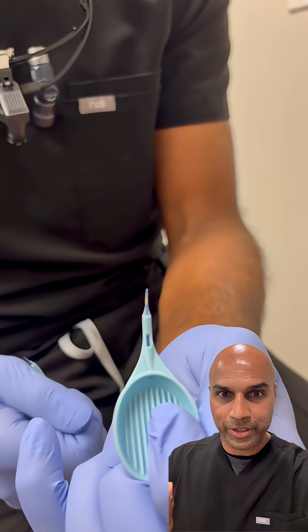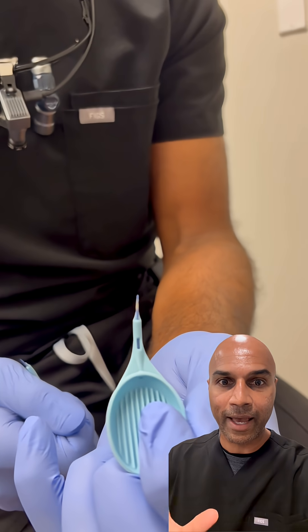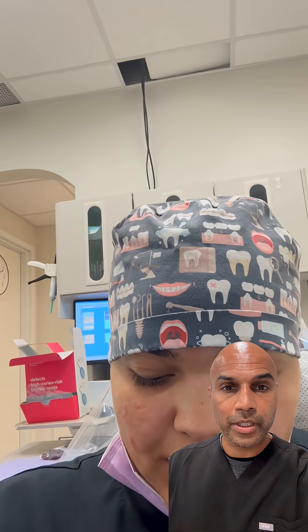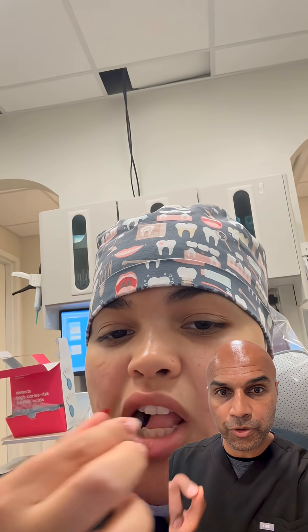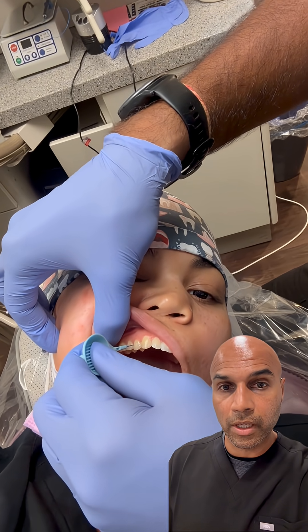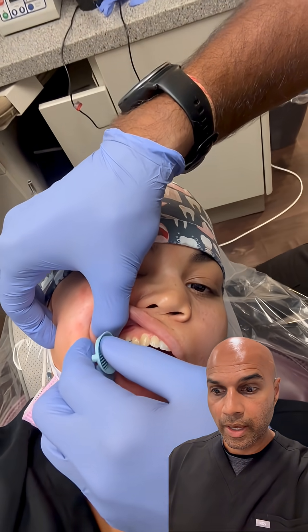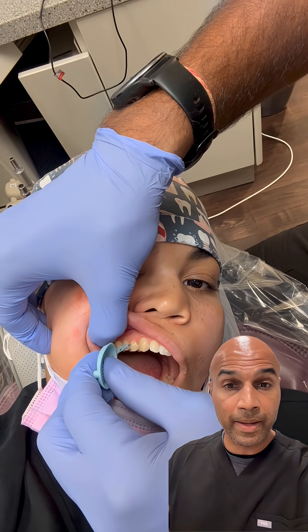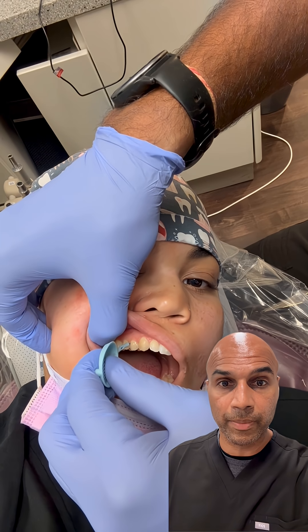Until I learned about this product called CaviSense. What it is — let's say you treat the patient, they come back six months later, and you have them chew on a little gummy. Then you stick a toothpick in between their teeth. This toothpick will change colors if the pH is lower, and the pH is going to be lower if the patient still has cariogenic bacteria in between their teeth — bacteria that was activated by the gummy.